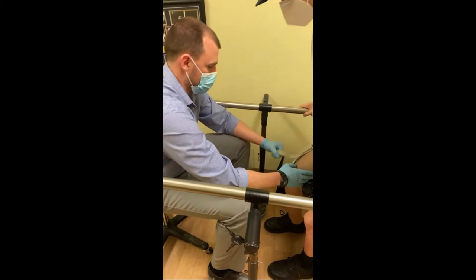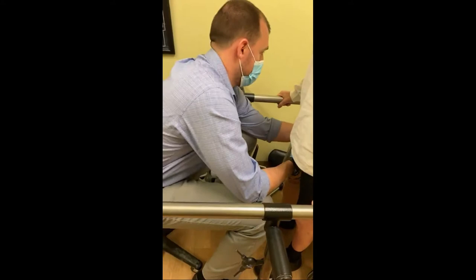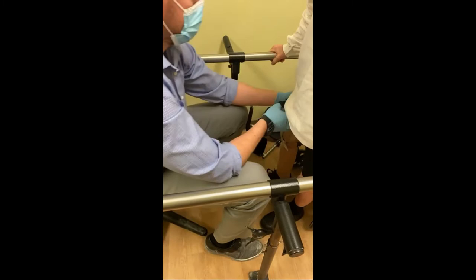All right, here we go. I'm going to pull it all the way back and get all that slack. Oh, it feels better already. Good. Let me just lift the prosthesis up and twist it a little bit. Pull this down. That's pretty good — that's really good as far as what I'm feeling.